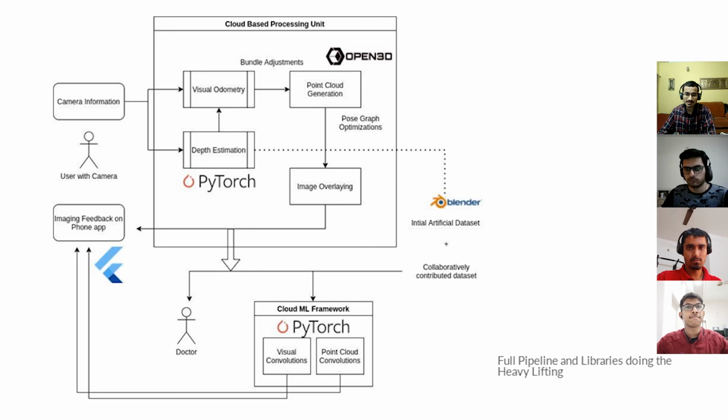We have four broad modules in our solution. First, our users take a video feed of their mouth. The cloud processing unit stitches them together. The ML framework generates diagnostic results. This pushes the generated scans back to the phone app, and then Blender is used to generate the initial training dataset. Hopefully, over time, we will get a crowdsourced dental dataset on our app to refine our model as well.